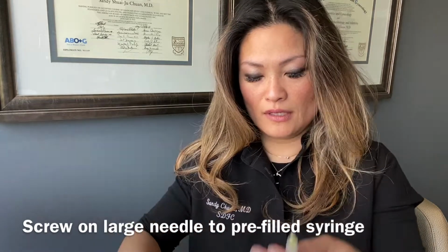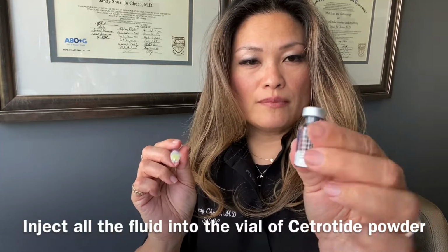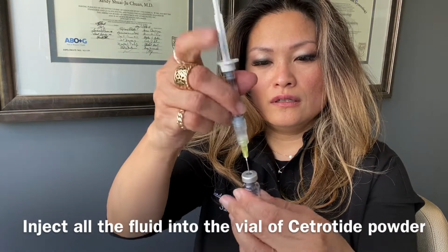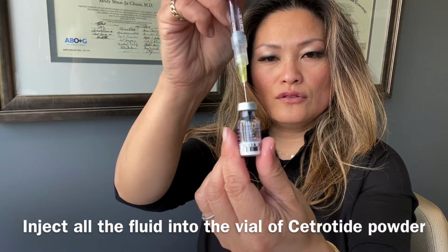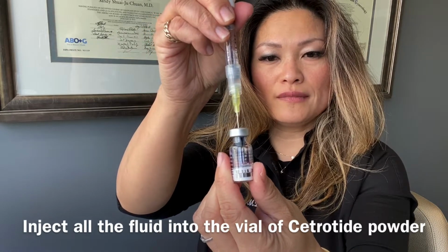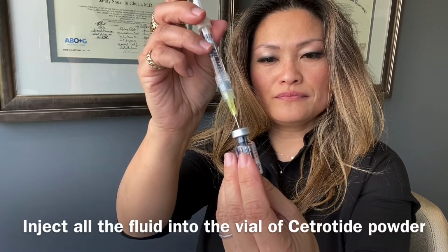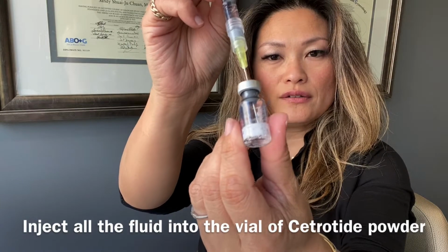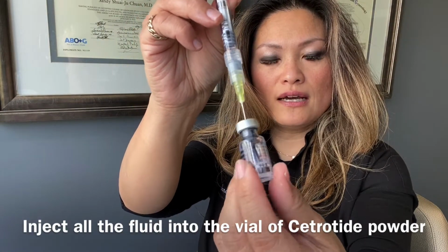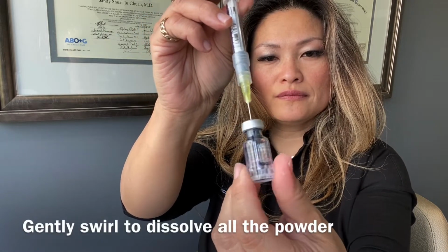Uncap it. And then what you want to do is you take your Cetrotide powder. You see how it's a powder form, and just like everything else that you see, you just want to kind of put that into the needle. And this one's a little bit harder to push the fluid in, so you might have to push a little harder, okay? And it'll start to dissolve. You'll see it here. This one's a little bit stickier. Sometimes the powder gets stuck on the side, so just kind of gently swirl it and keep pushing your fluid in. All right.